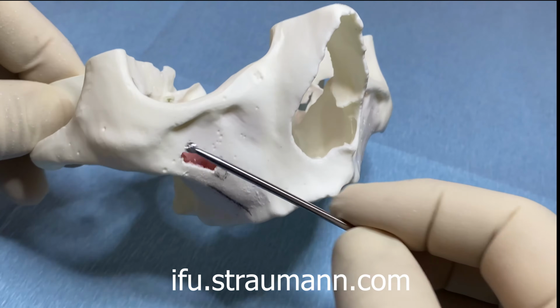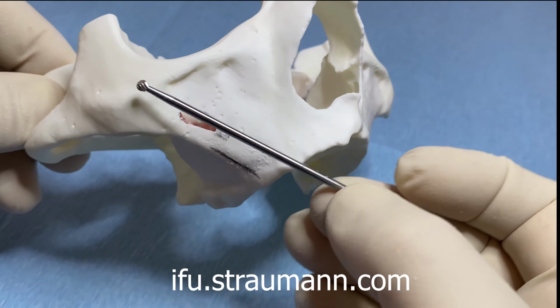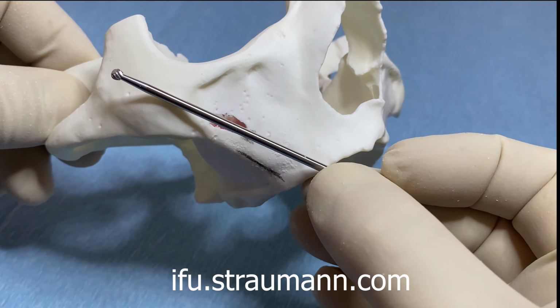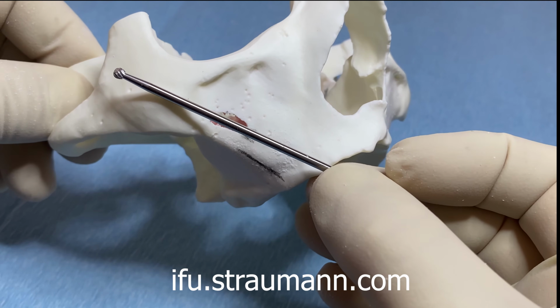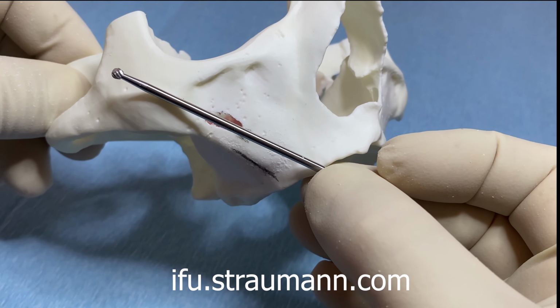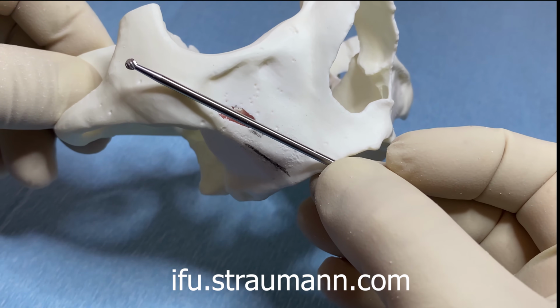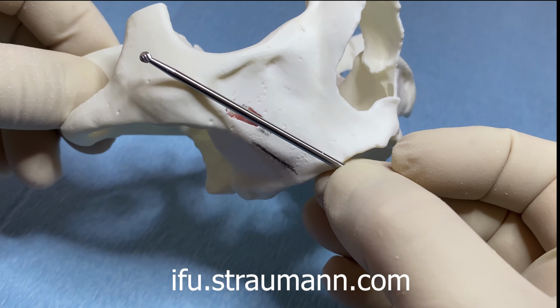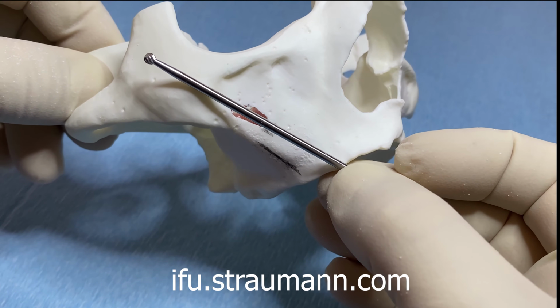So what I usually do is I visualize the path. So there's the frontal zygomatic notch. If I place the tip of my round burr at the frontal zygomatic notch and I parallel the back of my sinus window with the shaft of my drill, you can see at the crest I'm at the second bicuspid, first molar.